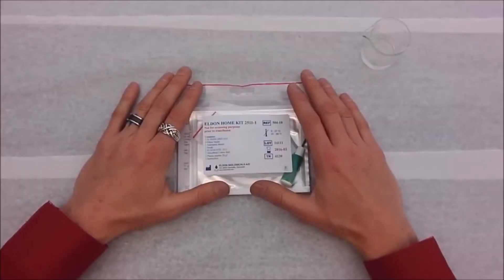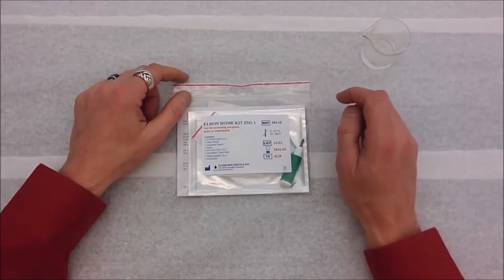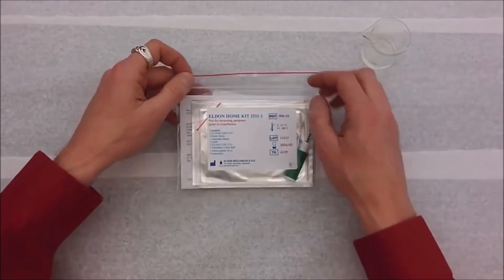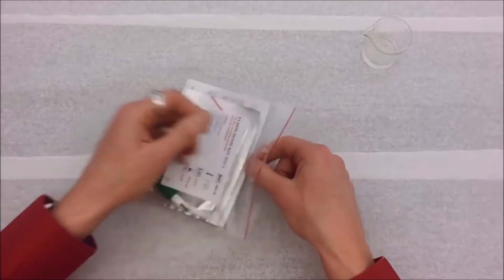Welcome to Anatomy and Physiology at Glen Oaks Community College. I'm Dr. Ren Hartung. For this video I'm going to blood type myself to show you how to use one of these take-home kits and talk to you a little bit about blood typing.